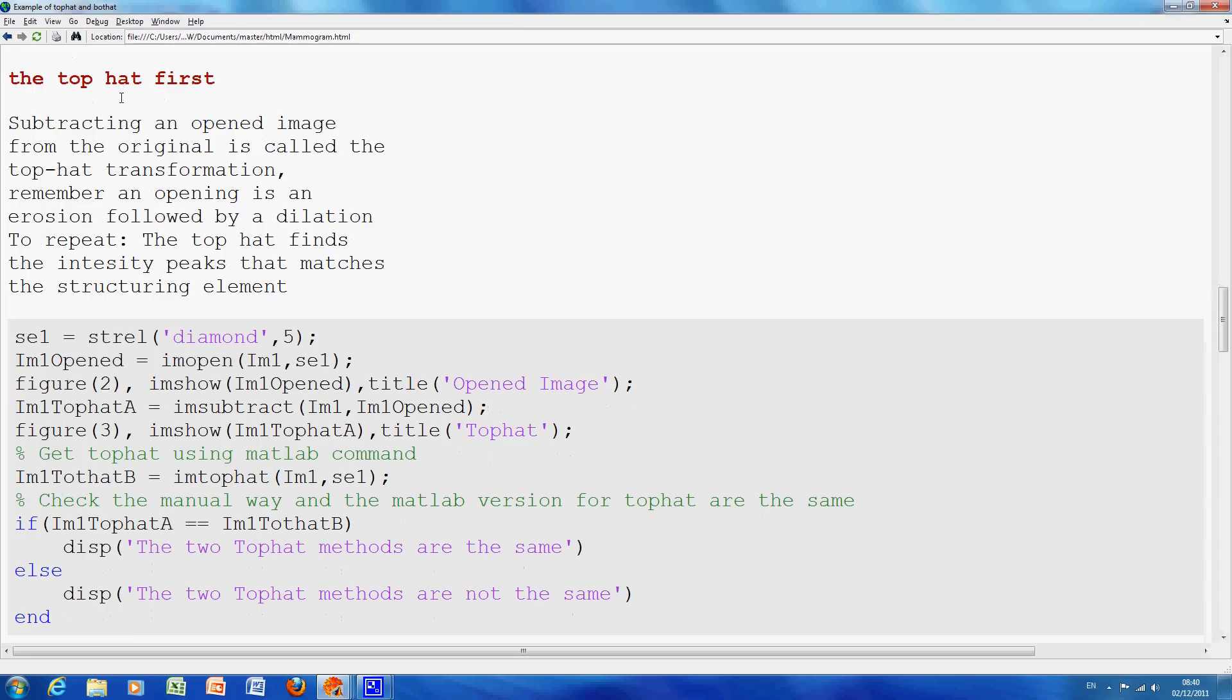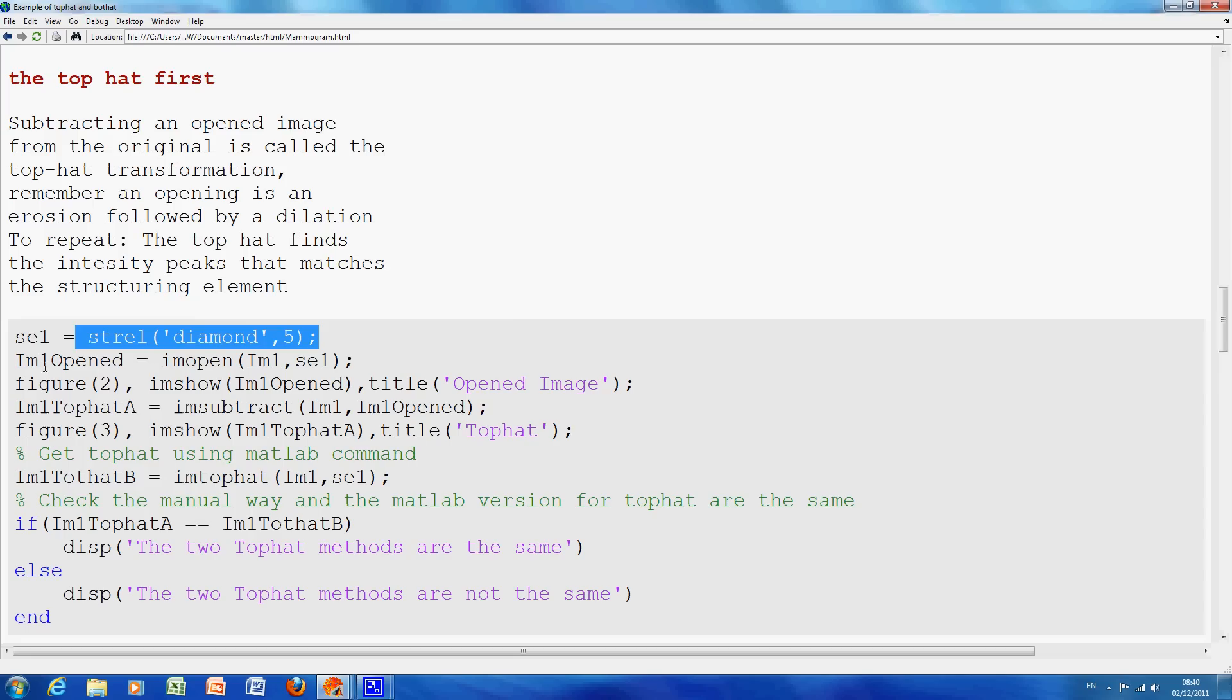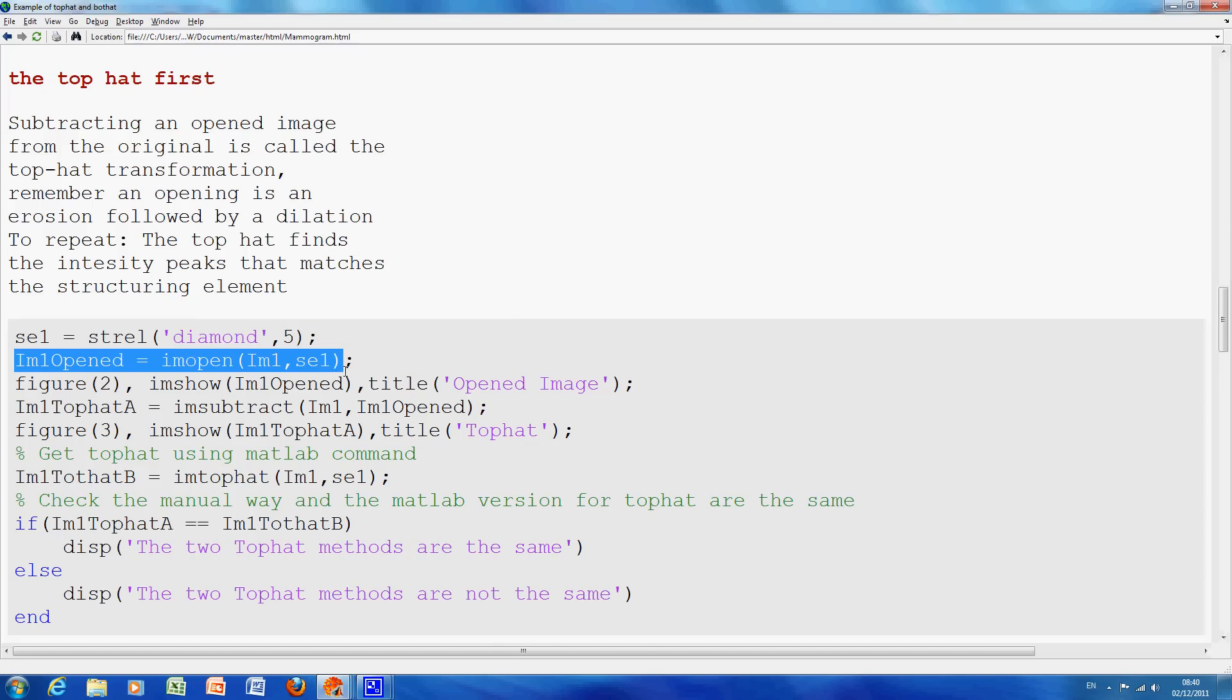So, we're going to do the TopHat first. I created my structuring element. Now, it's only by trial and error that you know what the appropriate structuring element is. And we found it's diamond five, I'm sure a circle would be fine. I opened the image, and if you remember, an opening is an erosion followed by dilation. What will that do? Well, the erosion followed by dilation will get rid of the small isolated white bits. And also, if there was a large white figure, it would get rid of the pointy bits, the sticky out bits, the burrs.